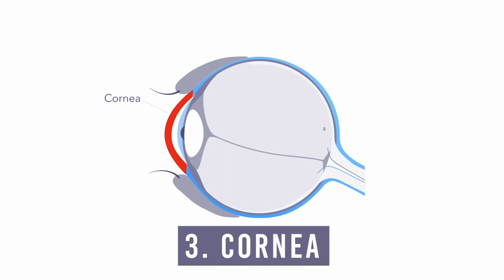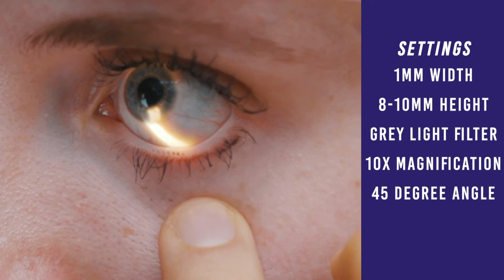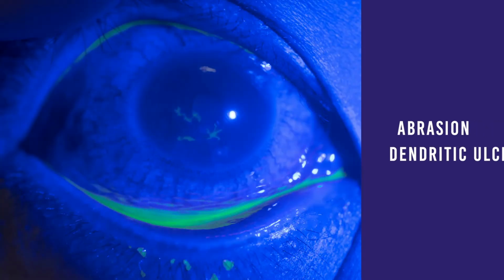Now we'll examine the cornea. So turn the beam to 45 to 50 degrees to give you a better cross section. Scan from side to side and the cornea should be a clear window. So here we're looking for opacities such as infection or a corneal scar and defects on the corneal surface such as a corneal abrasion or a dendritic ulcer. You can use fluorescein staining at this point if it's indicated.